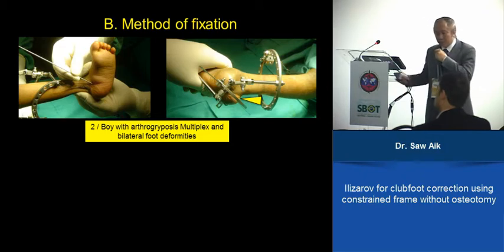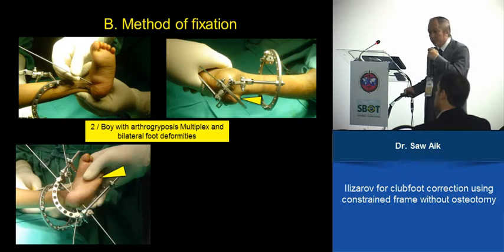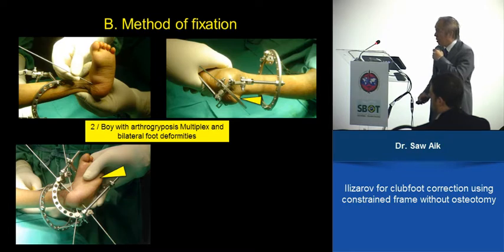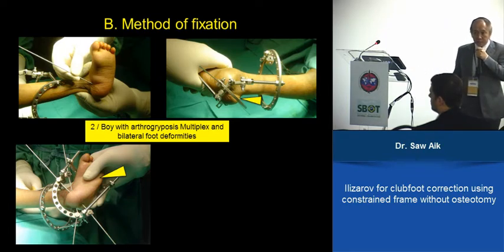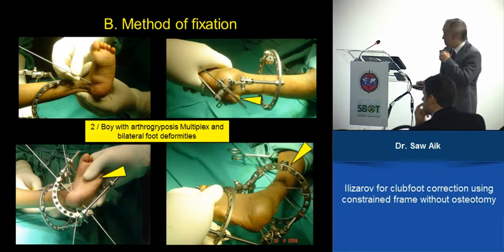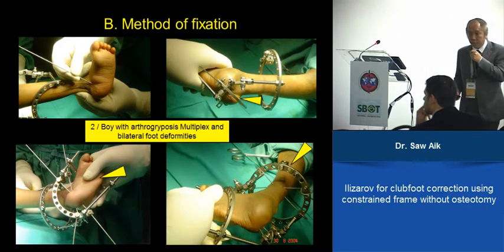After putting the first ring, we usually take an image intensifier just to confirm it is in the calcaneum. After having two wires over the calcaneum, you go to the metatarsus — one wire over the fifth metatarsus and one over the first metatarsus. Then you go to the tibia, which is positioned so that on the AP and lateral view it is perpendicular to the tibia bone.